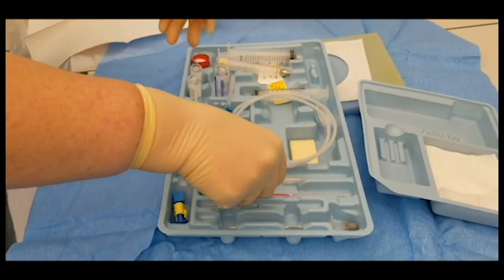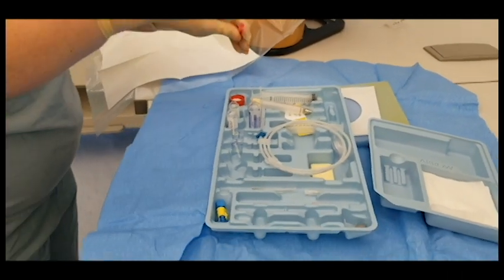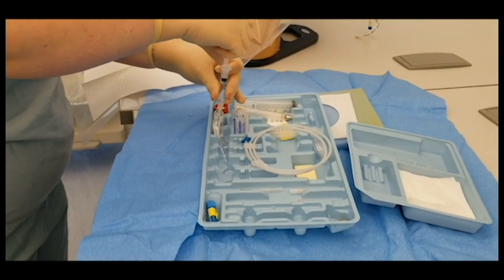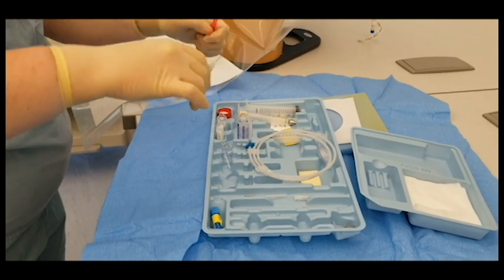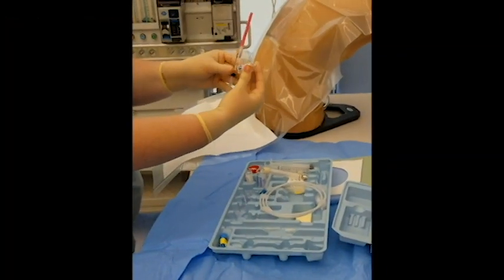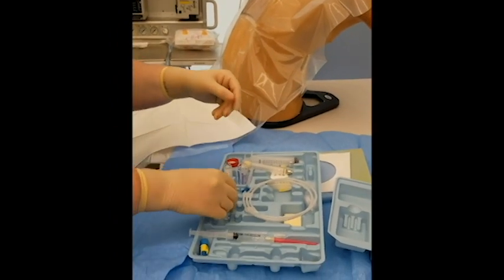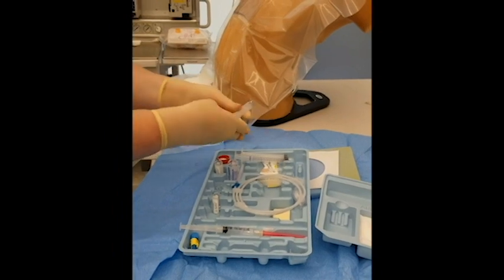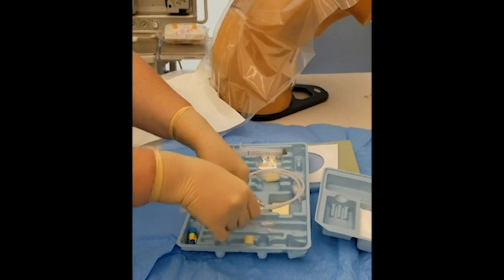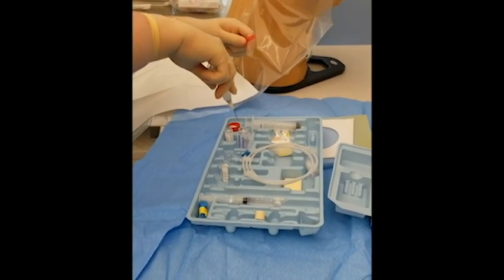Also draw up 3 cc's of your test dose, which is lidocaine with epinephrine, totaling 45 milligrams. Then prepare your loss of resistance syringe with air or water or both.